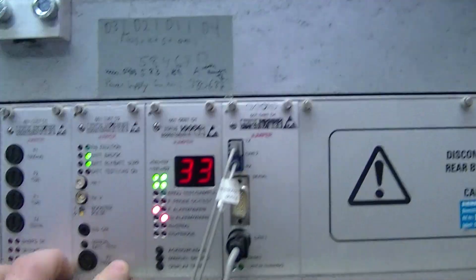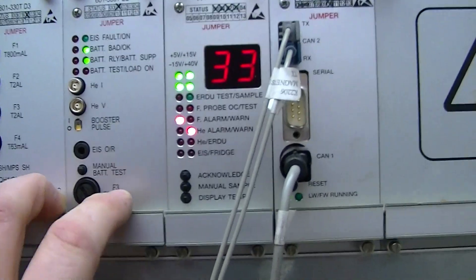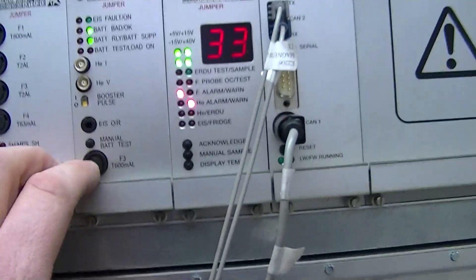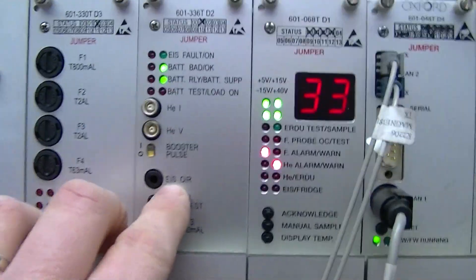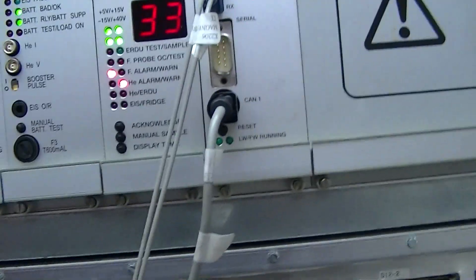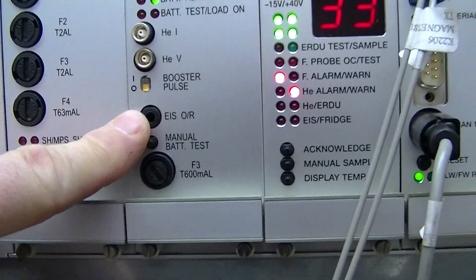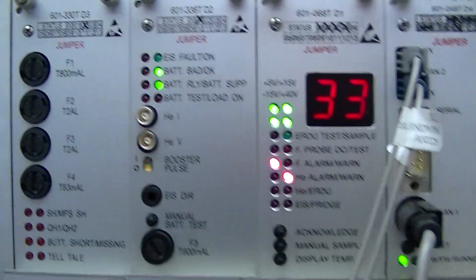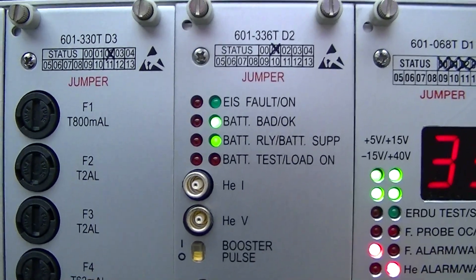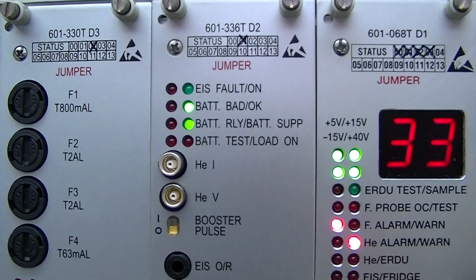Over here you have the D2 — somebody put a cool sticker up here so they could remember it. The D2 is what's going to have the manual battery test, your EIS or external interference shield reset. There's an actual plug you can put in there and that will turn on the shield for a longer period of time if you need to build up some pressure. It's also got some fault indicators on there — it'll tell you whether the battery is good or bad.